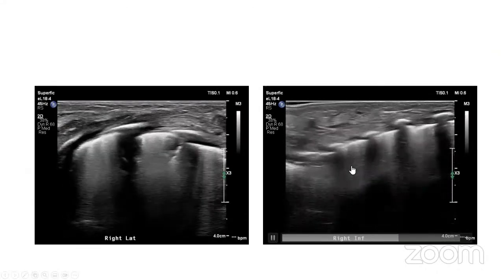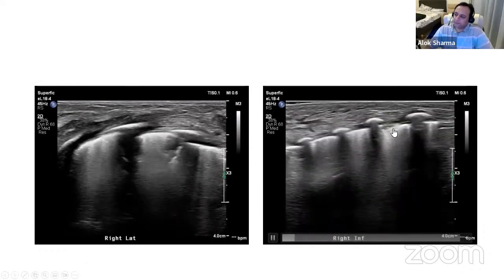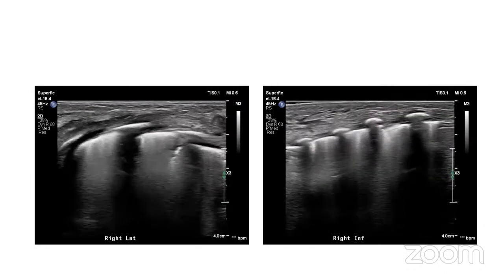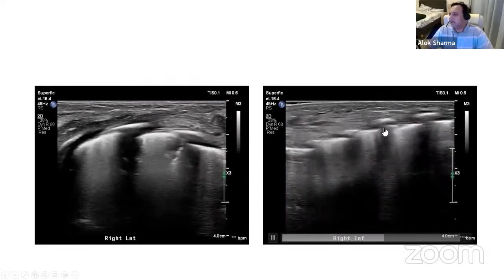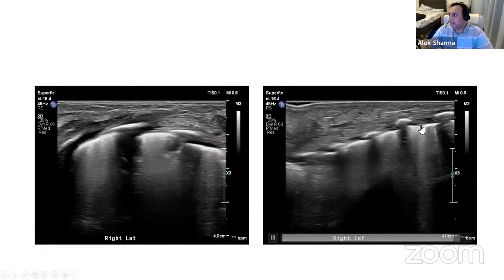Also, look, there's pleural sliding here. From this photo, on the left and right side, the pleura is a little bit irregular, with maybe some pleural consolidation and a lot of B-lines. Yeah, so I would agree. It's a B profile completely. You can't see anything A.